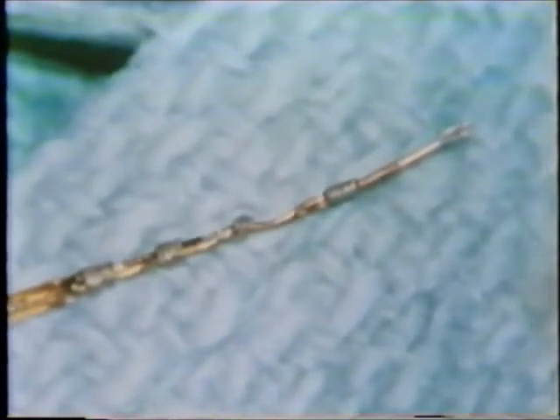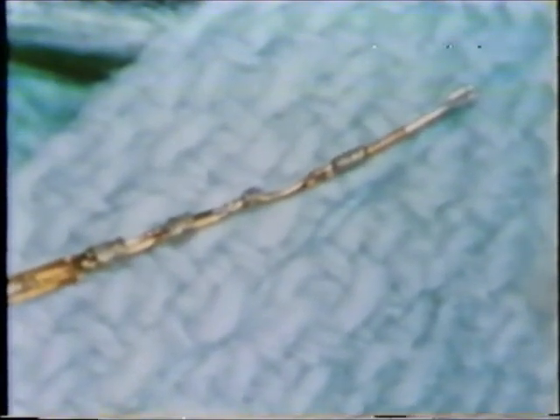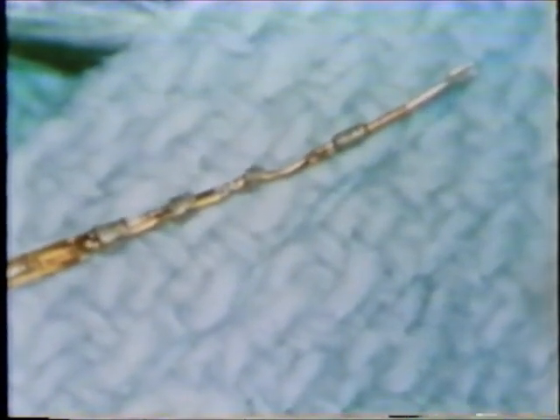From the electrode button, the five wires lead to the electrode endings. At the end of the electrode system, the wire is turned over, and then each of the other endings are twisted around the bundle of wires so that we can have exposed surfaces of the electrodes. This entire system is then introduced into the scala tympani.